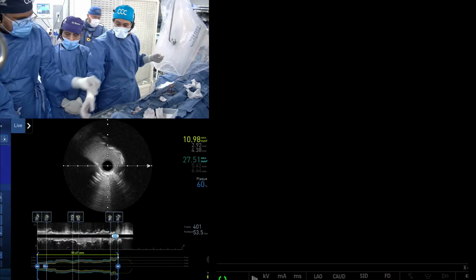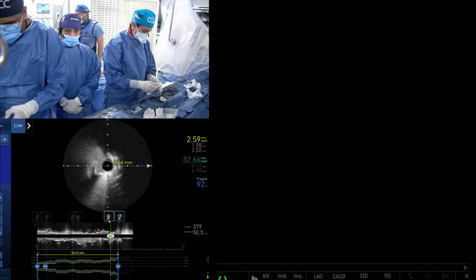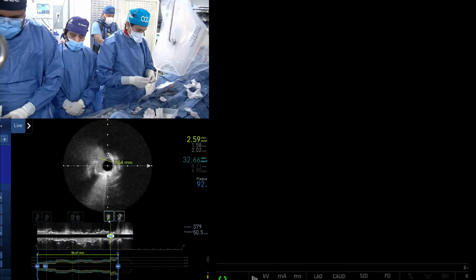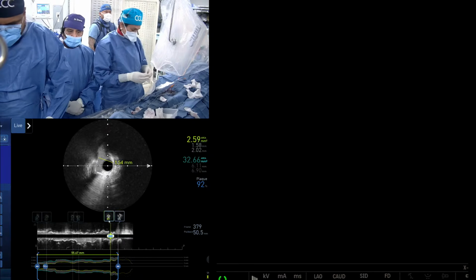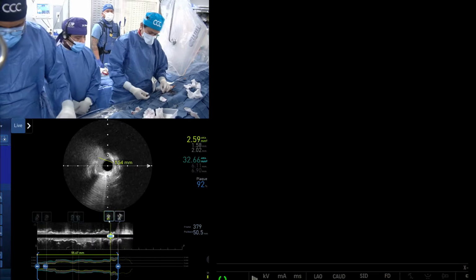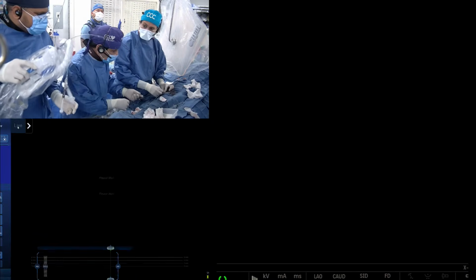And right now, as you know, at Euro PCR they're presenting the data of the Bolt Medical IVL, which is Boston Scientific. We were the lead enroller in the United States, and overall the second enroller worldwide, because we were allowed, I think, 44 or so cases. That looks like very good data. They'll go to the FDA and expect approval before the end of the fourth quarter of another IVL in our market.